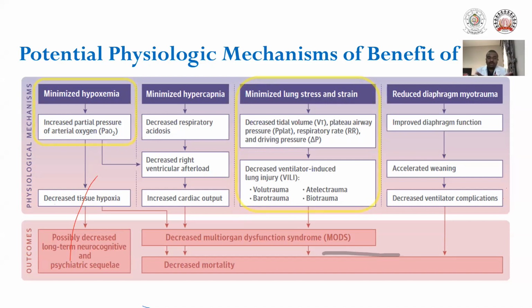You can see in this one figure all the indications and physiological mechanisms to benefit from ECMO. Based on a large body of evidence from patients with ARDS, this significant decrease in VILI is thought to be more important to clinical outcomes in most patients with ARDS receiving ECMO, as compared with the patients who are not receiving ECMO.